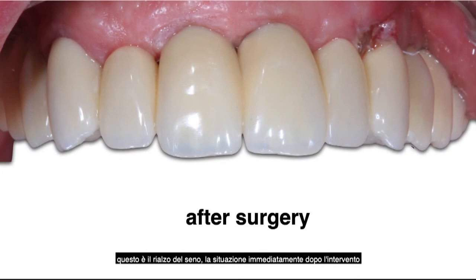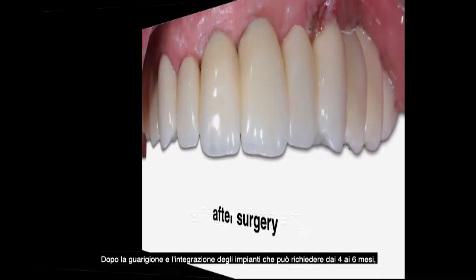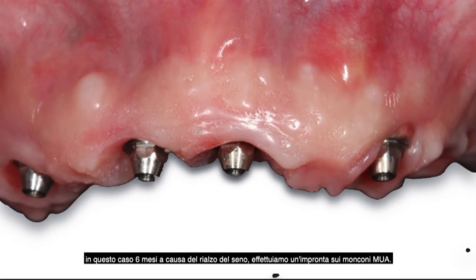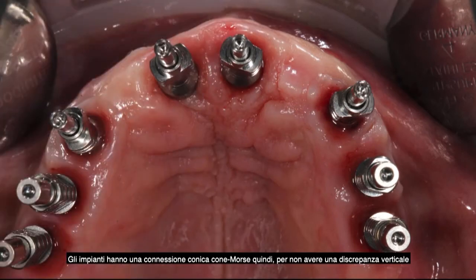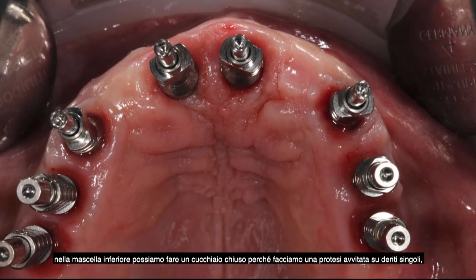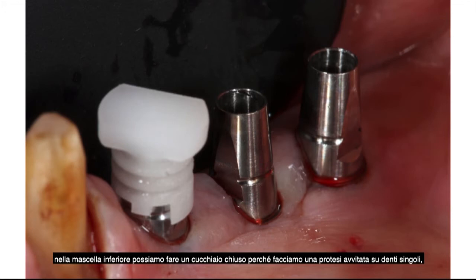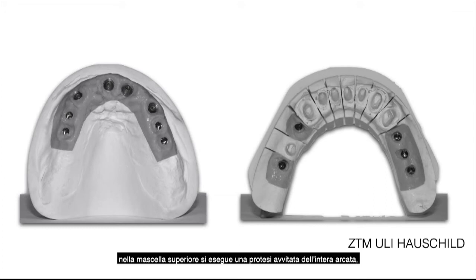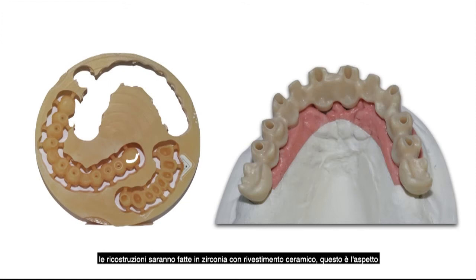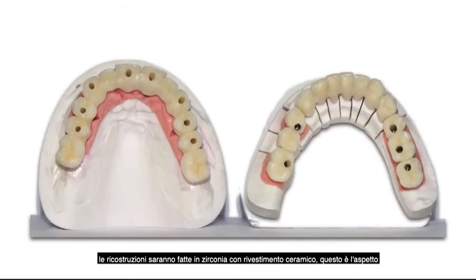The situation immediately after surgery looks quite good and minimally invasive. After implant healing and integration — in this case six months because of the sinus elevation — we take impressions over the multi-unit abutments. Due to the more conical connection, to avoid vertical discrepancy in the impression, all upper jaw impressions are done over multi-unit abutments with an open tray. Lower jaw uses a closed tray for single-teeth screw-retained restorations. The upper jaw restoration will be full-arch screw-retained; the lower jaw, single teeth screw-retained. Constructions are done in a zirconia frame with ceramic coating — the result is a very happy patient with a high jump in quality of life.